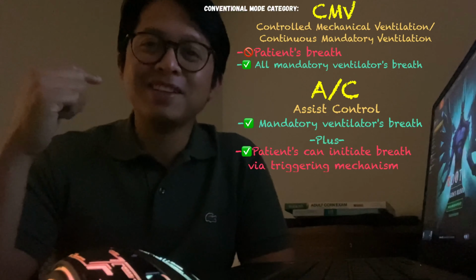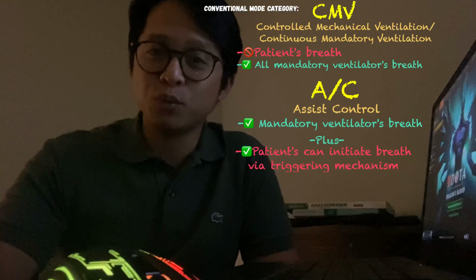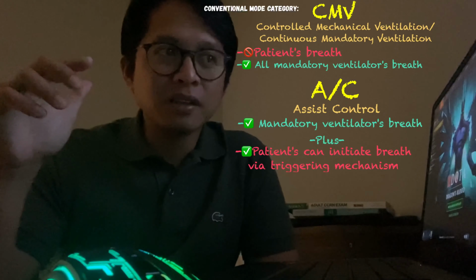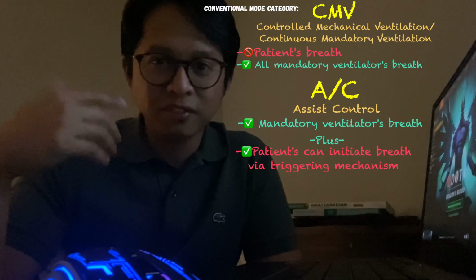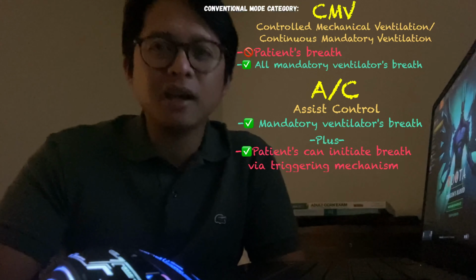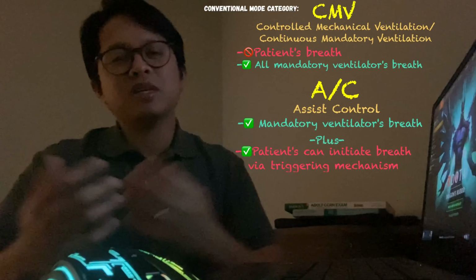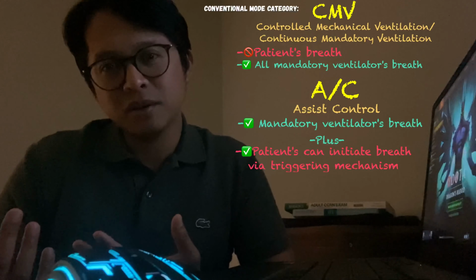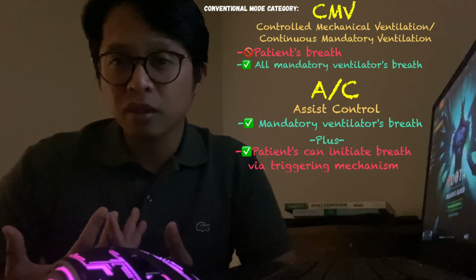Well, let's not wait for the remaining seconds. I'll give you what you want." Then the ventilator will initiate a breath at a set flow rate and a set tidal volume. And after that, the vent will wait again for another 6 seconds to initiate a breath if the patient does not trigger a breath.